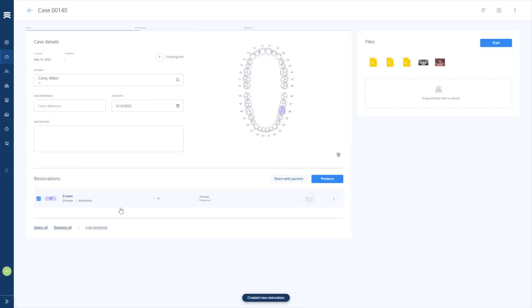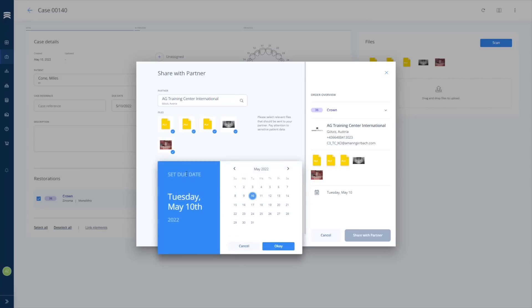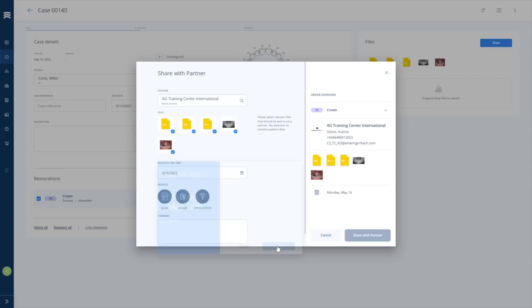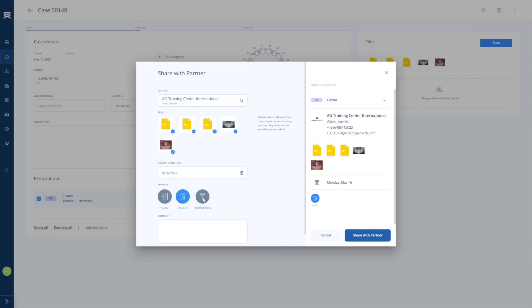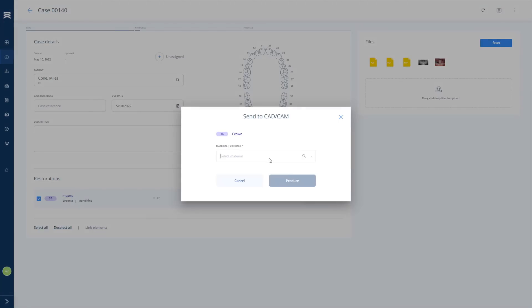From here there are really two options. The scan files plus your other files — for example pictures, radiographs, etc. — can be shared via AG Live with a Ceramil partner lab to offer same-day dentistry for your patients. Or, what I'm actually doing here, is sending the files to the clinical CAD software to start the design process directly in the clinic.